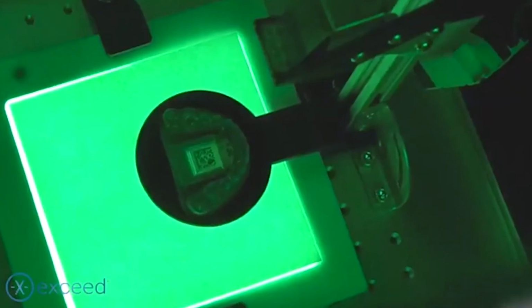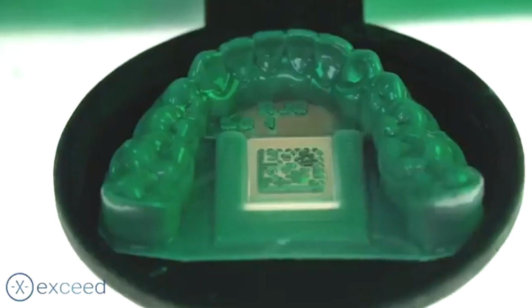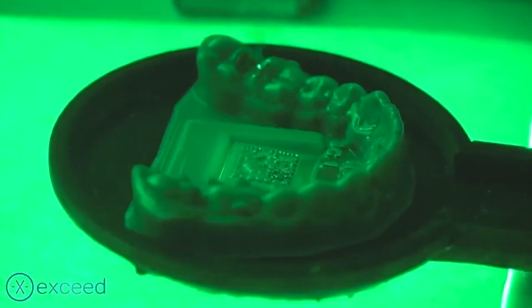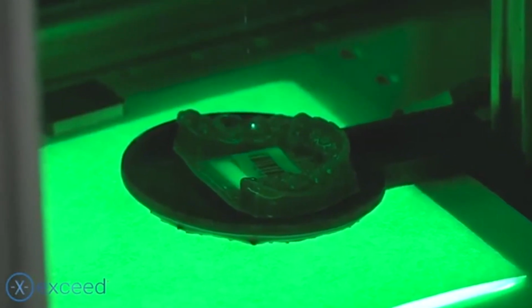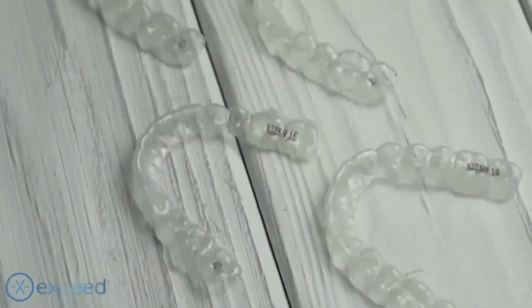We use the laser for marking the aligners. There are many machines available, two types of lasers on the market at the moment. Fiber laser is more affordable, about 10,000 USD, but the markings are very bright and therefore visible on the teeth. And also you have the UV laser for 20,000 USD that makes the marking less bright and therefore more preferable.